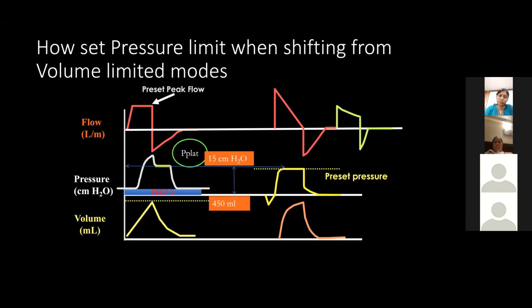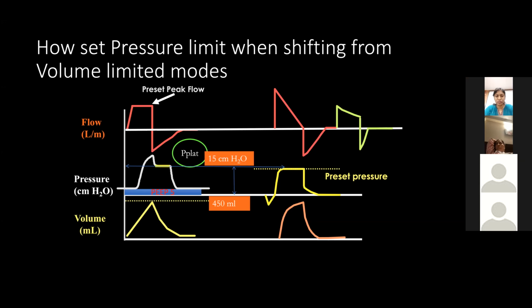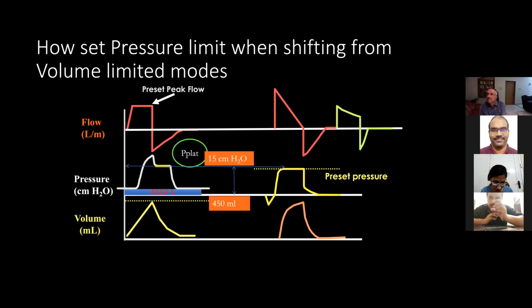Understood? Again, pay attention. When you are changing from volume control ventilation to pressure control mode, you check the plateau pressure.